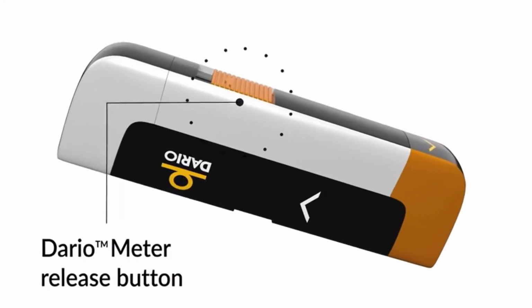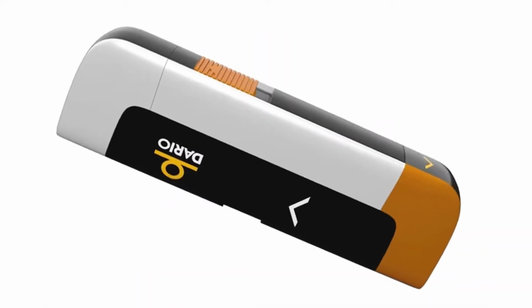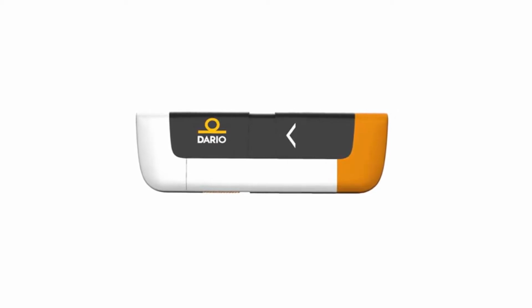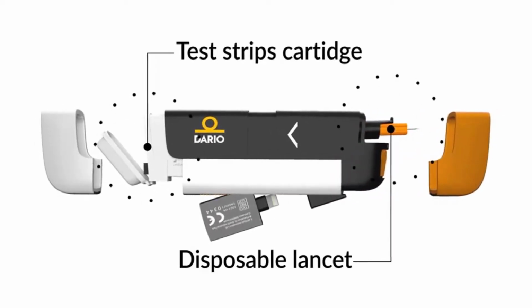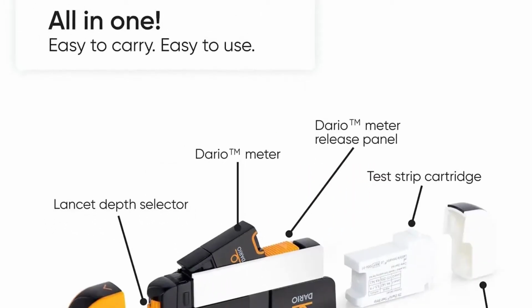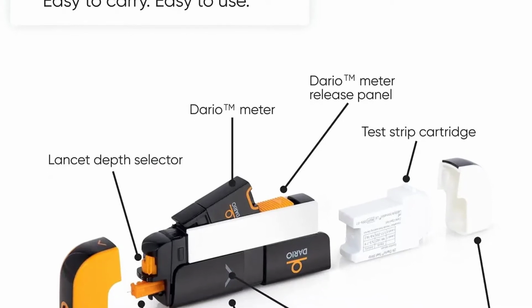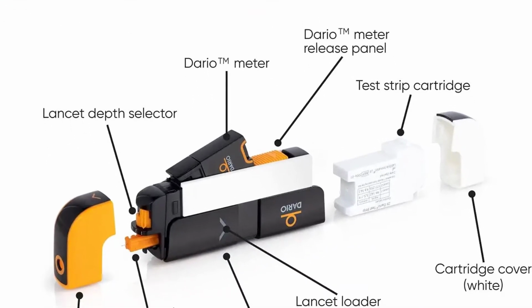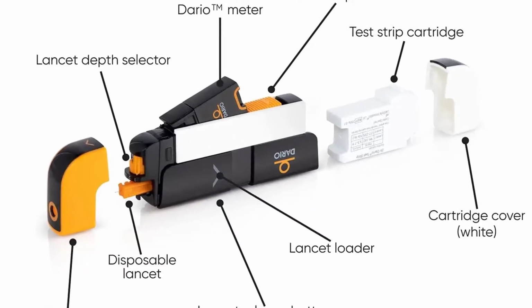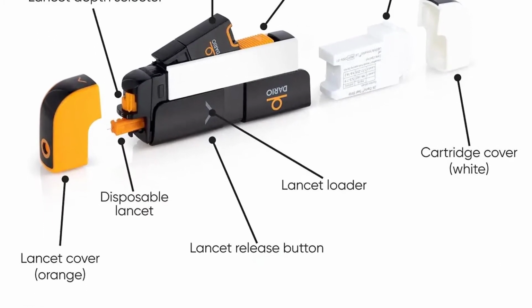Supported iOS phones: 6, 6 Plus, 6s, 6s Plus, 7, 7 Plus, 8, 8 Plus, X, XS, XS Max, XR, 11, 11 Pro, 11 Pro Max, SE 2020, 12, 12 Mini, 12 Pro Max, 13, 13 Pro, 13 Pro Max. iOS operating system: iOS 13, 14, 15. Application version 5.6.1.